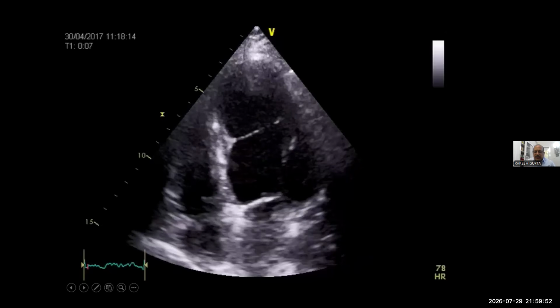There is a very high likelihood of embolus or thrombus formation in this aneurysm. I don't say it is not present in a dyskinetic segment, but it is more in aneurysmal segments. So you have to hunt for any thrombus.